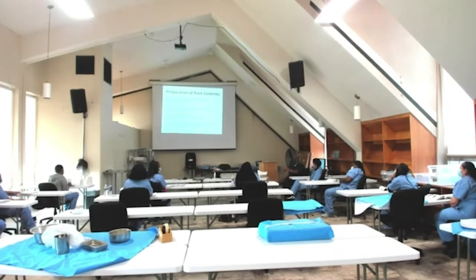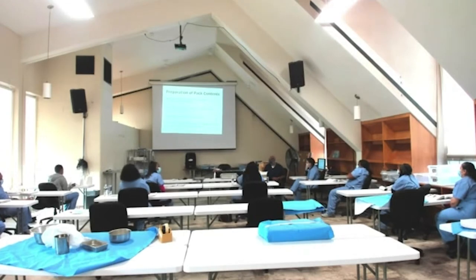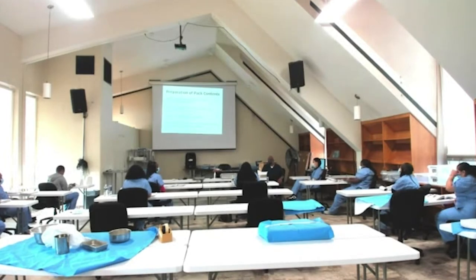These tip protectors that I'm showing you that we use are sleeves. Some hospitals may still actually have the plastic ones that go over. We use what they have. We don't go in there and get snooty, right? Because everybody doesn't have HUP money. Everybody doesn't have Jeff money. Those hospitals are well funded.